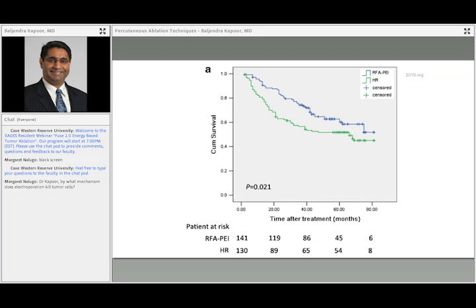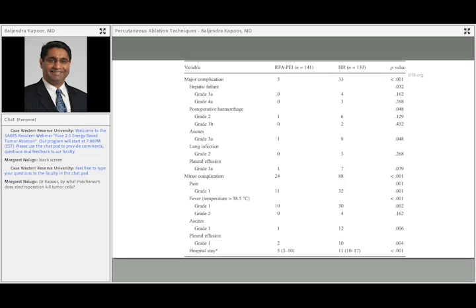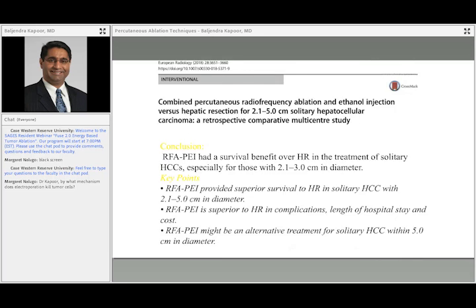And this is another graph. And they compared these in two groups of the patient. And this is the complication chart where they showed that the complication rate was less, according to them, in this group that was treated with RFA and percutaneous ethanol as compared to the hepatic resection.